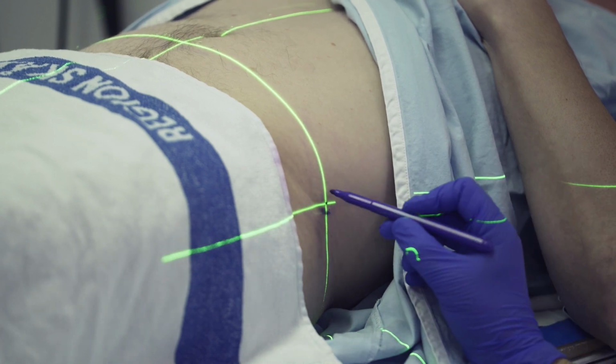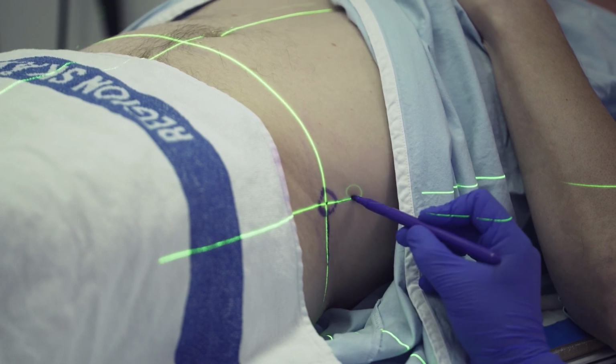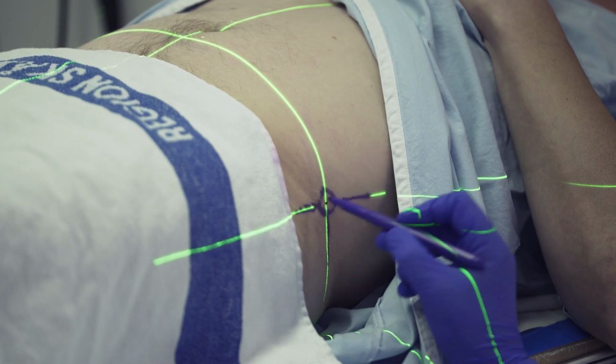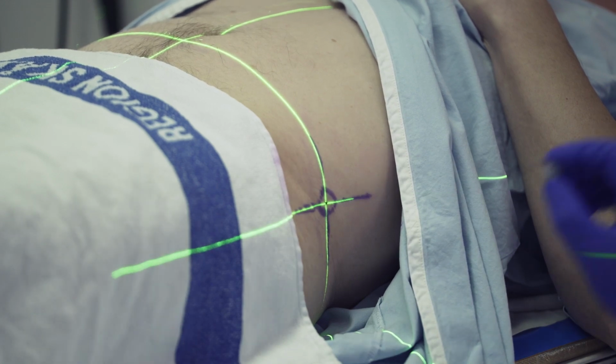Put the patient on the table and place your tattoo spots at your reference points. Always make sure to use an MRI-compatible ink not to cause image artifacts. The external markers are attached to the reference points and visible in the MRI images.